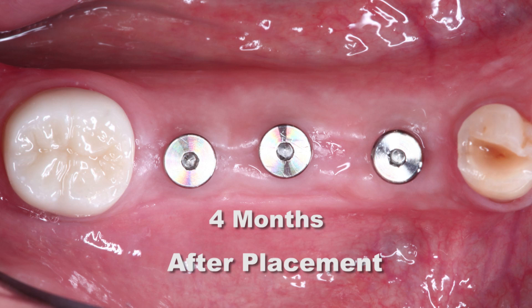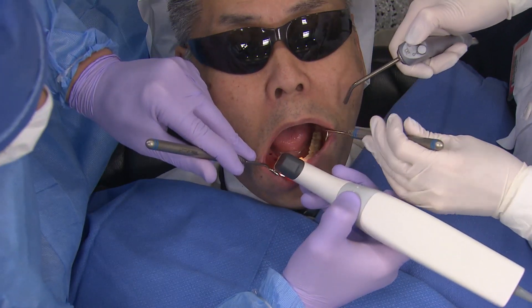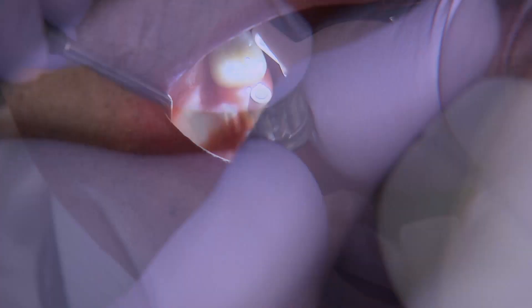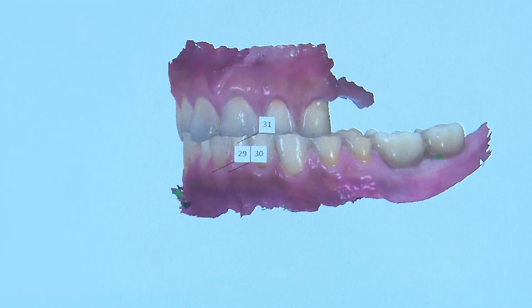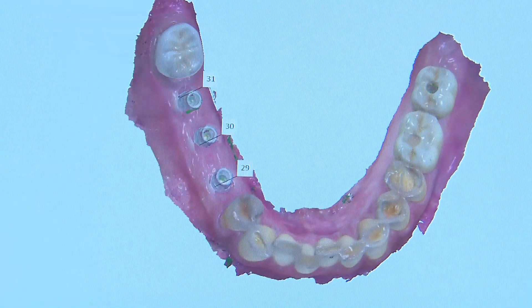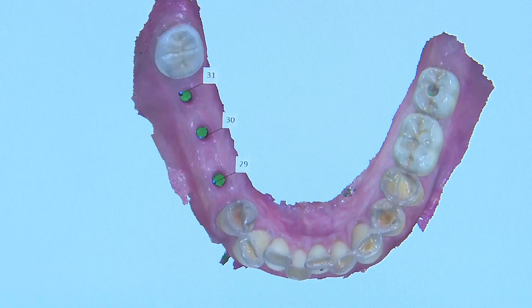As you can see, the sutures are in place. Four months later, the patient returns for the final impression appointment. I decided to scan these implants and take the digital route to fabricate the final restorations, so I place scan bodies on top of the implants. I always take a radiograph to make sure that the scan bodies are in the correct position and seated properly — otherwise your final restorations are not going to seat all the way. I take the scan with the scan bodies in place, and this information can now digitally be sent to Glidewell for the final restorations. We have all the information: the arch we're working on, the opposing, and the bite registration. Within the software, I mark the numbering of the teeth for the final restorations.